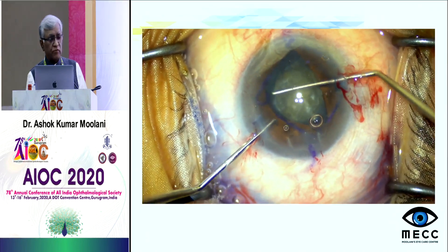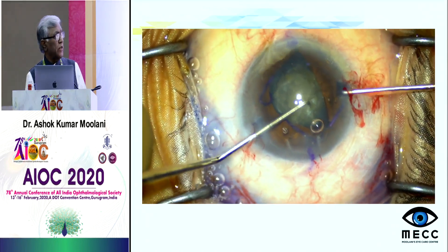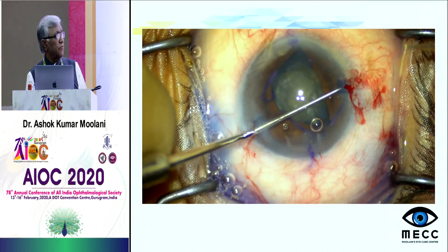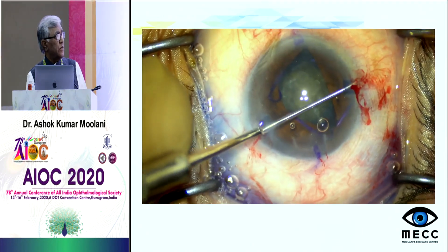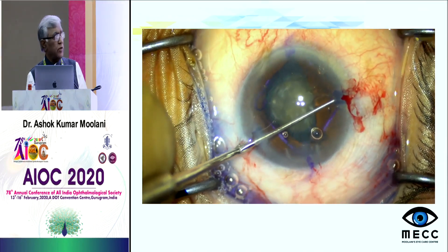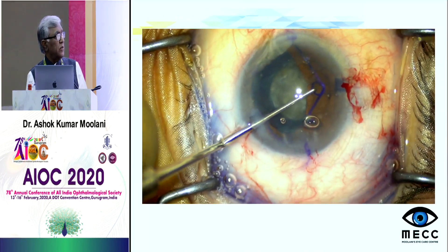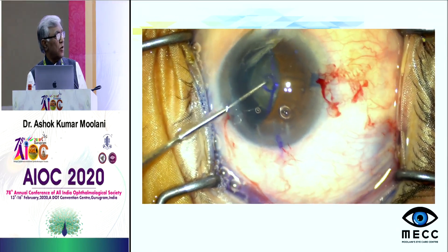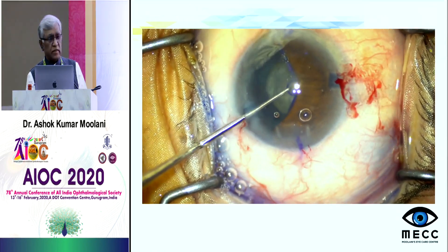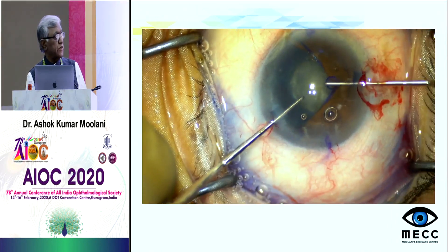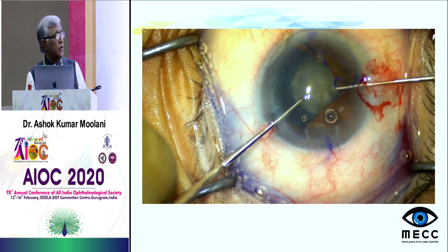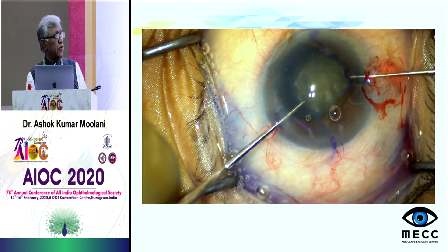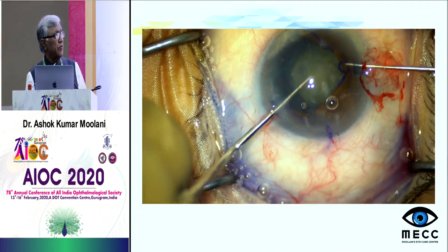After completely placing the Malyugin ring in all four positions, we have a diamond-shaped pupil which becomes more round because it has eight-point fixation, and you are able to perform the phacoemulsification uneventfully.